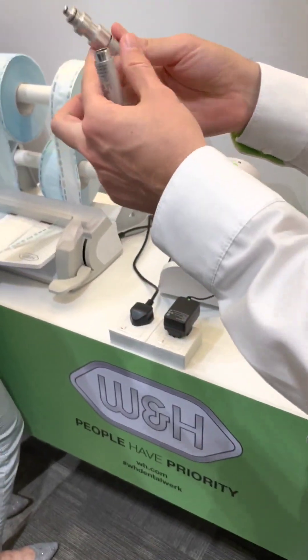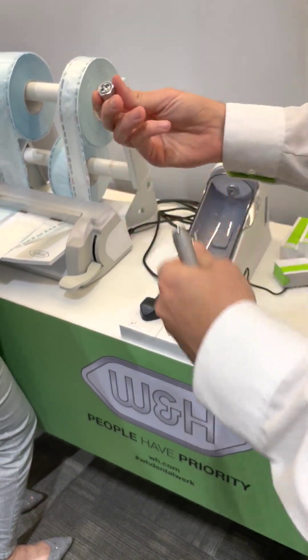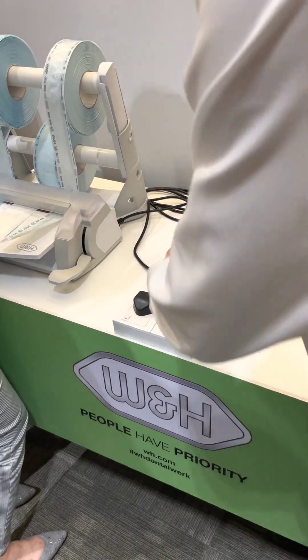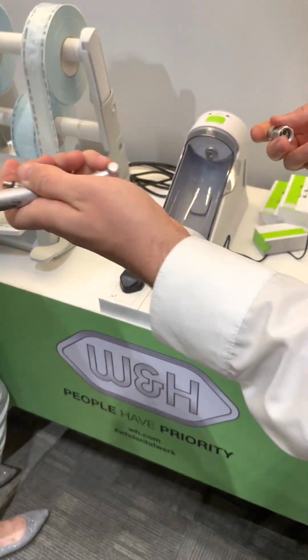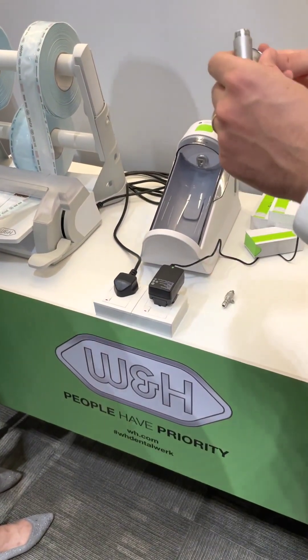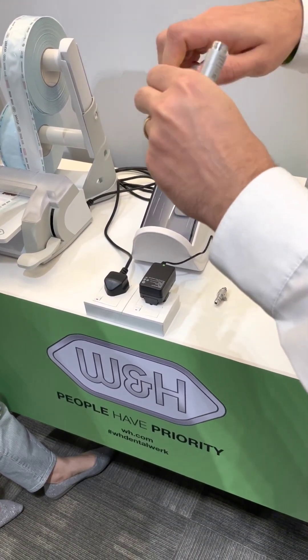This is the standard adapter, the RAM, that fits here. If you have, for example, a Roto-Quick or Carvo Multiflex connection, you attach the adapter.